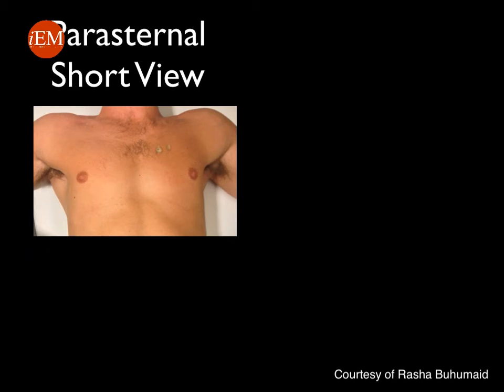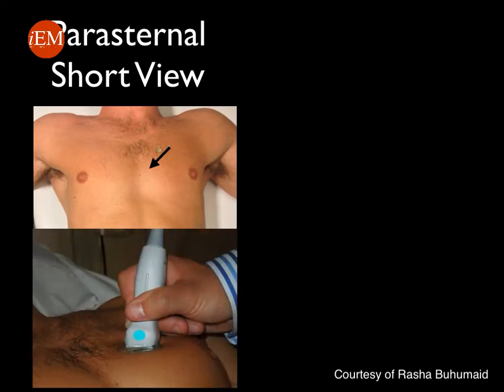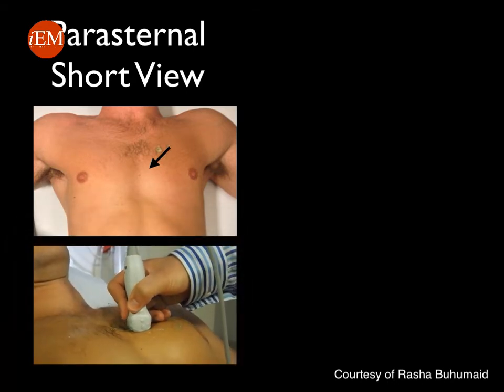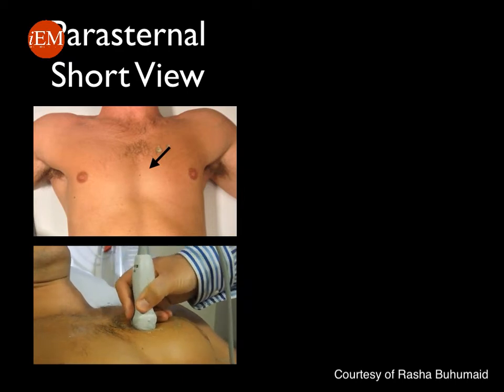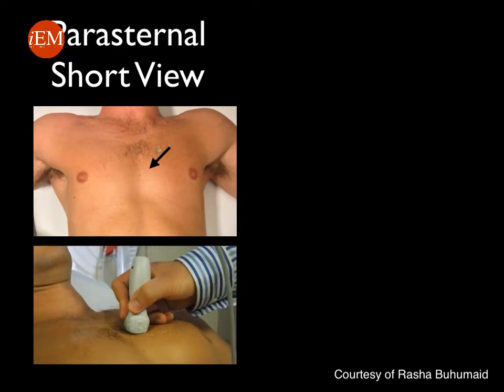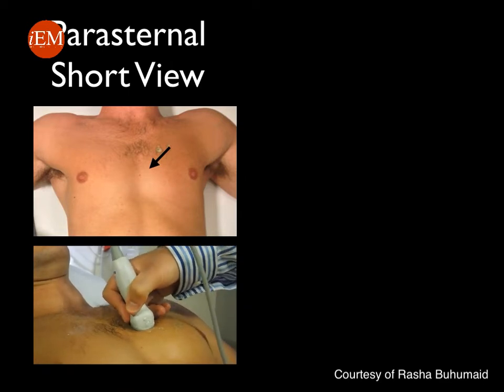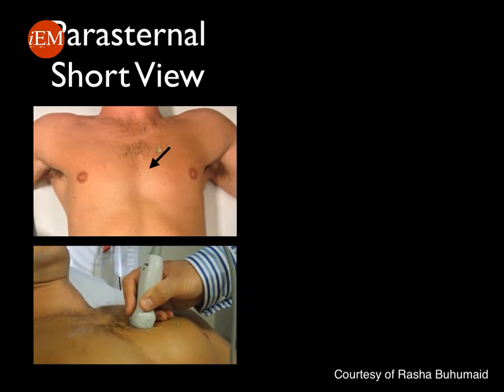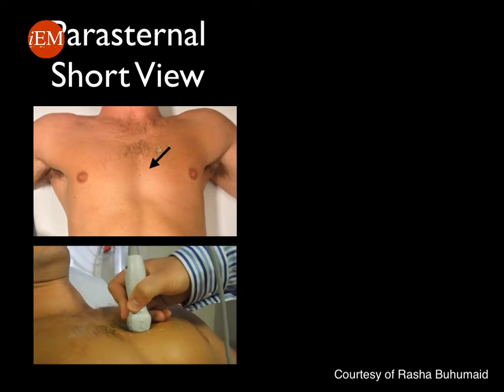To obtain a parasternal short view, you keep your probe exactly where it was in the parasternal long view, between the third or fourth intercostal space, and you just rotate the probe marker so that it is pointing towards the patient's right hip this time. The image you obtain depends on the angle of your probe. Note the sonographer is tilting the probe towards the patient's right shoulder and then towards the apex, which will produce different images.